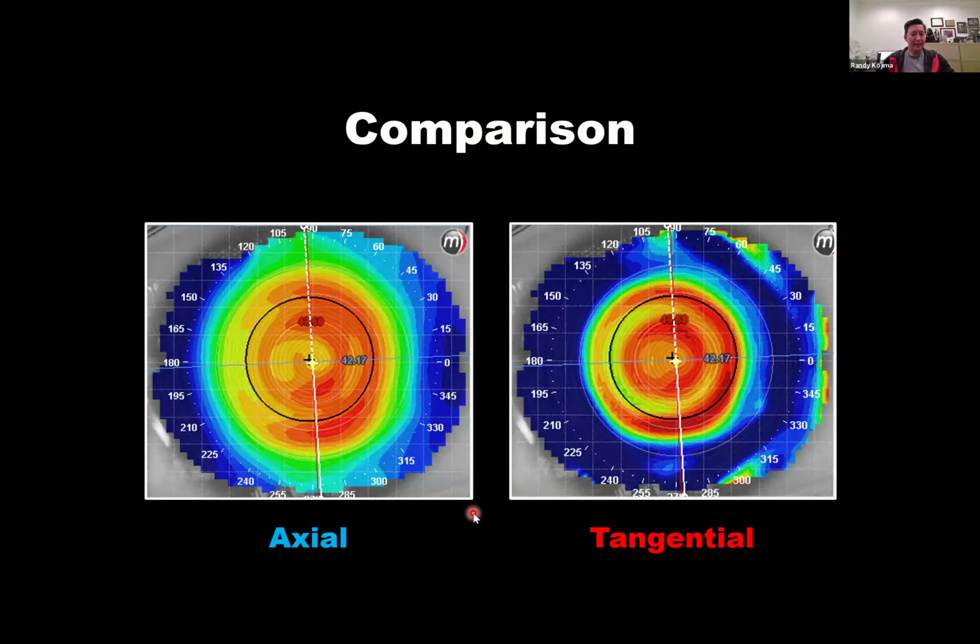So the axial can give you some insight, and again, it's power. But the tangential is so good about finding changes in the surface that in the case of mapping over the top of soft multifocal lenses, the tangential is probably the best choice.